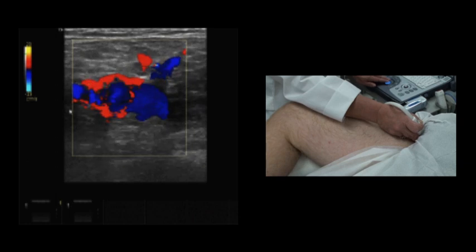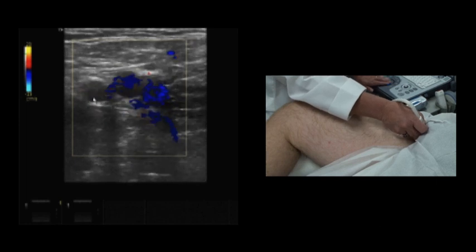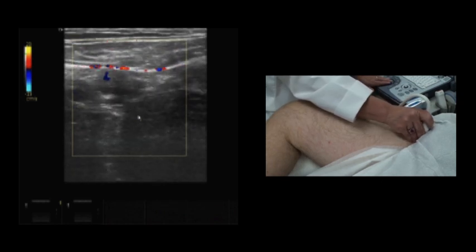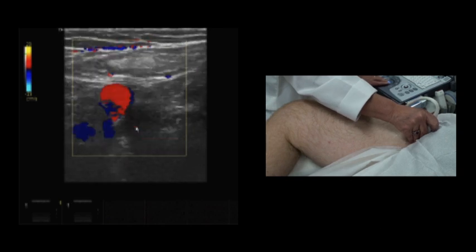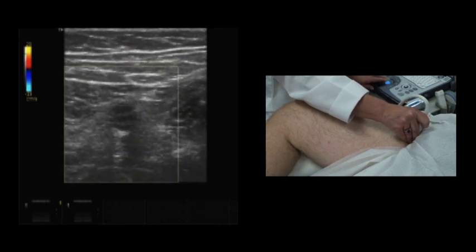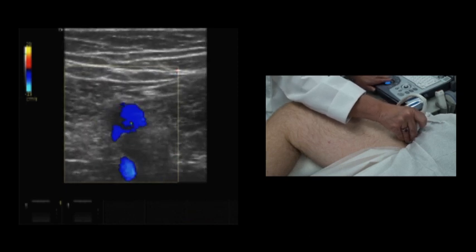And now as I scan inferiorly, we can see the takeoff of his profunda, the profunda artery. And now as I scan inferiorly, we'll see the takeoff of the profunda vein. And then that leaves us with the superficial femoral artery. Here we have the profunda vein, superficial femoral vein, superficial femoral artery.